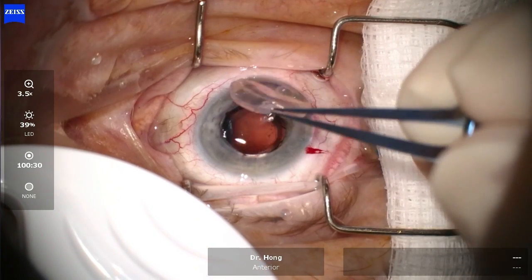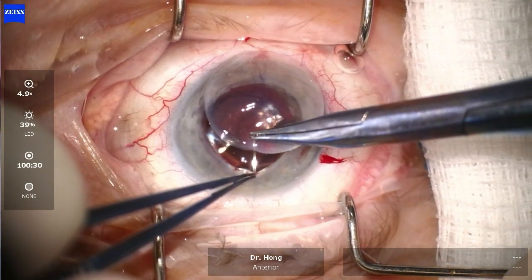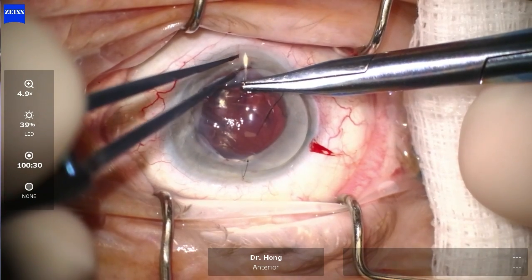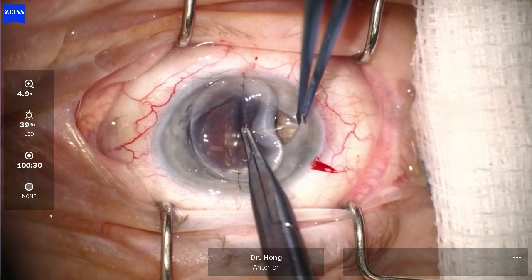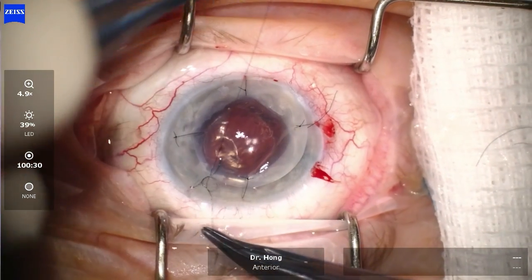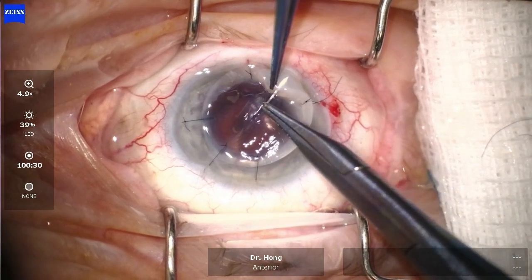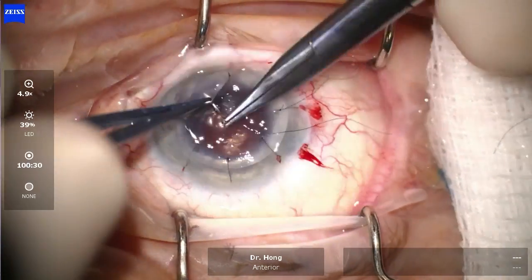The donor cornea was then placed over the defect and a 10-0 nylon suture was used to secure the graft. A total of 16 interrupted 10-0 nylon sutures were then placed.